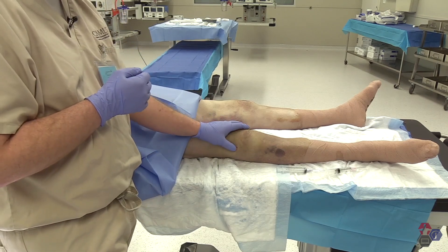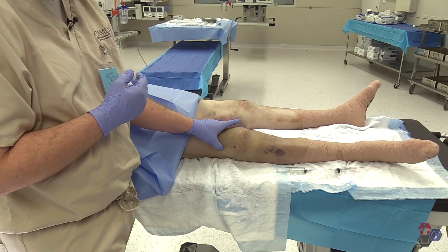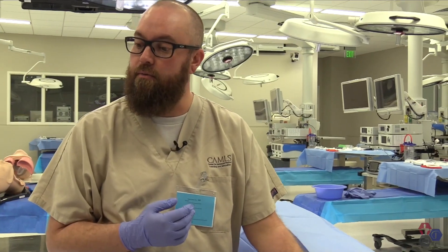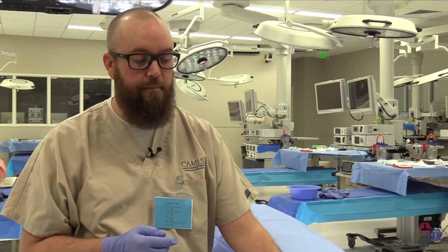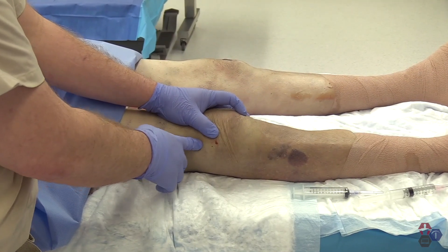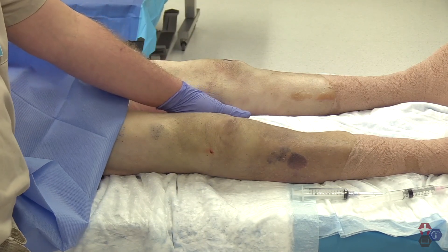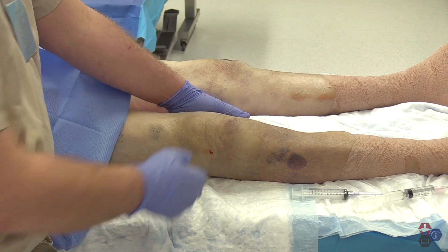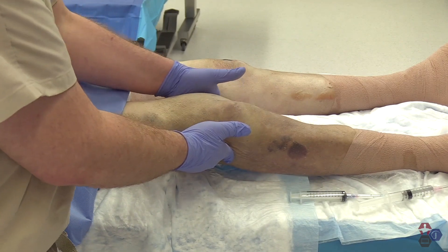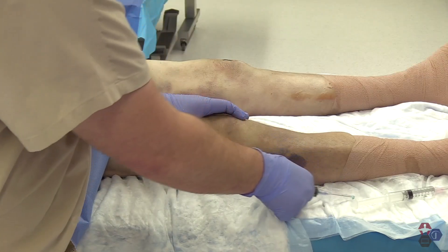My preference for the first approach is the superior lateral aspect. The easiest way to identify your landmarks is to place your index finger and thumb on the patella itself to stabilize it and create a little pressure, opening up the joint space. Another technique is to place a towel under the knee, creating 10 to 15 degrees of flexion, which will also open up the joint space and allow easier access to the bursa.